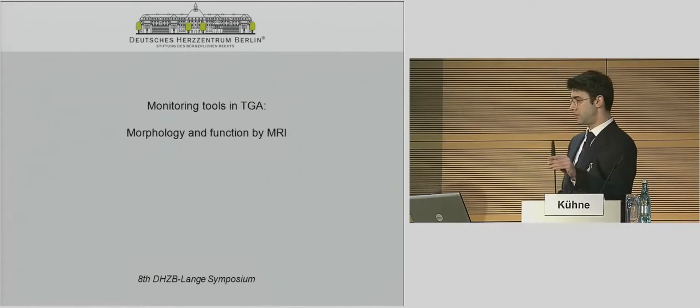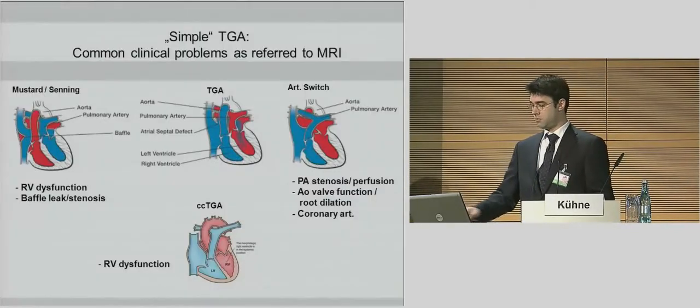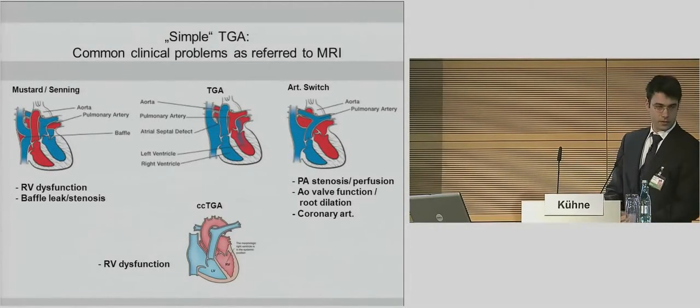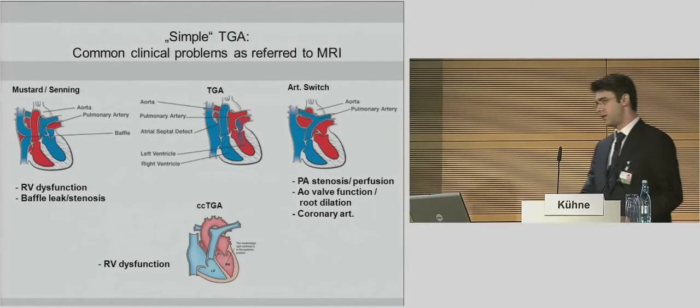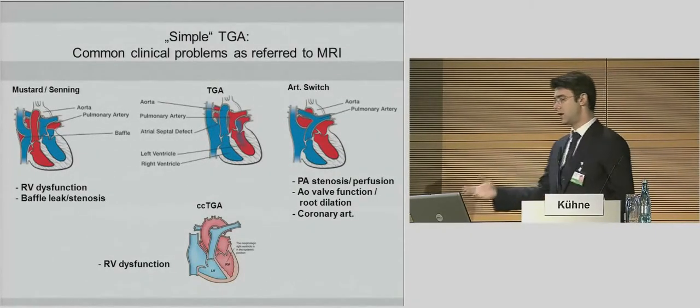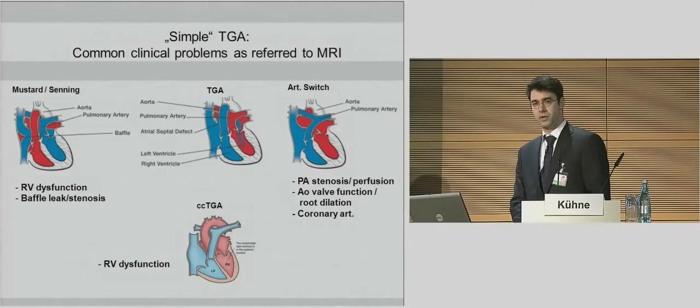I just want to start talking now about monitoring tools, MRI. So this is a good transition from echo. And I don't want to make it too complicated in this morning session now, talking about simple TGA, and I want to pinpoint some of the problems we discussed already yesterday several times.